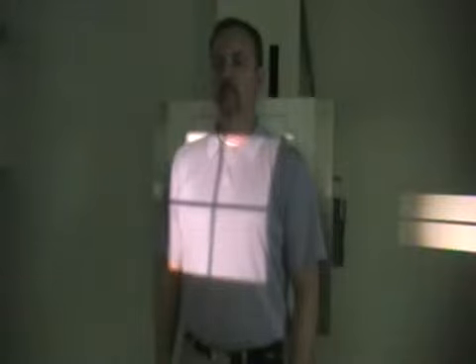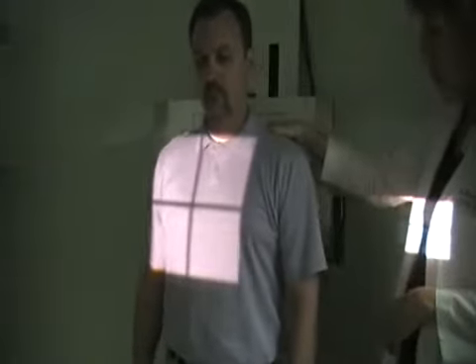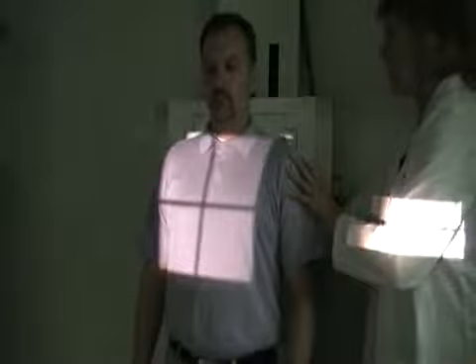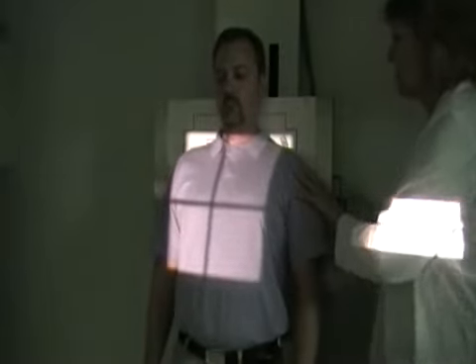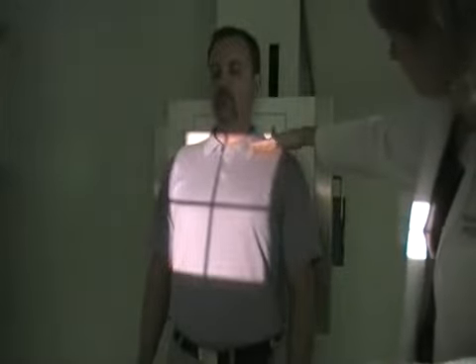I've got the film crosswise to cover the width of the chest, and what I'm going to have David do is take one step out and then lean back so that the shoulders are touching up against the IR. Okay, now take a small step to the right. There you go, right there. So the patient is angled back so that the clavicles will be thrown up above the apices.